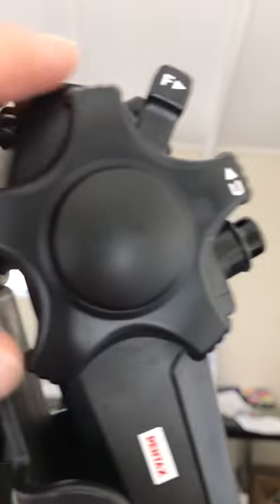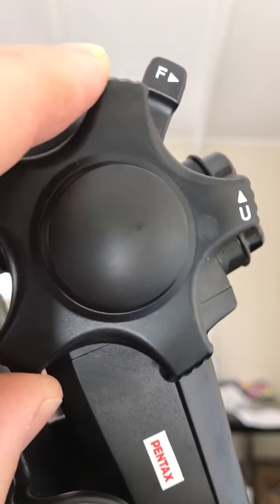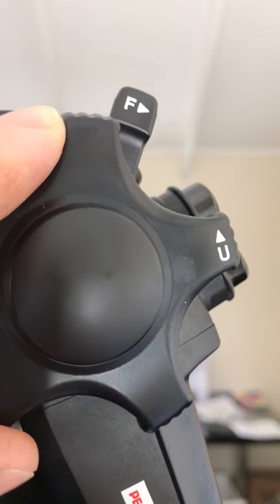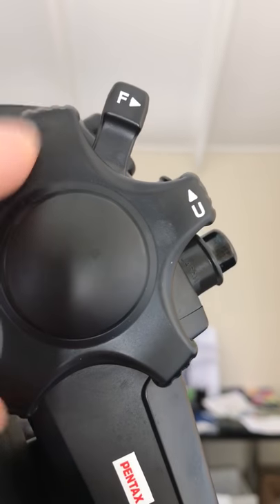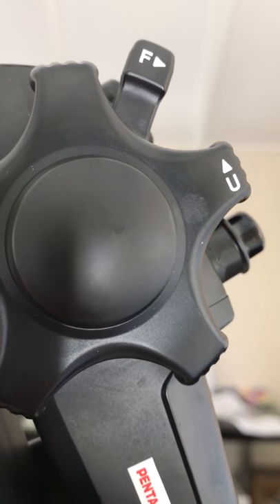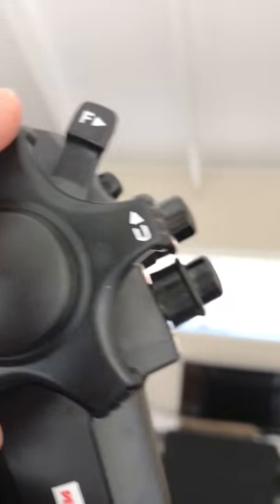So the deflection — let's have a look. We can move from 210 degrees to 120 degrees. The 210 degrees means that when you're in the stomach you can look back at the entrance of the stomach. This little lever here stiffens the deflection so you can stay in one spot inside the patient's stomach.